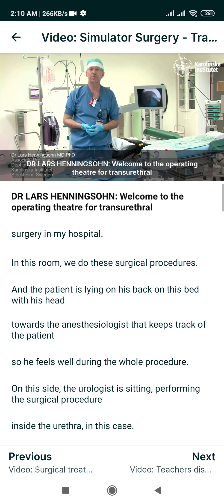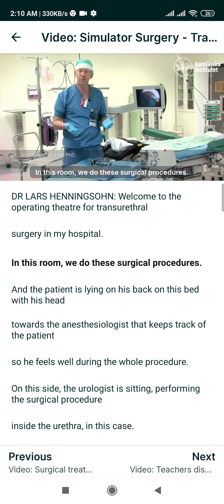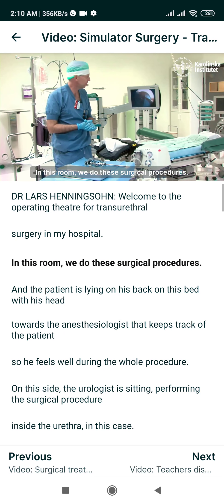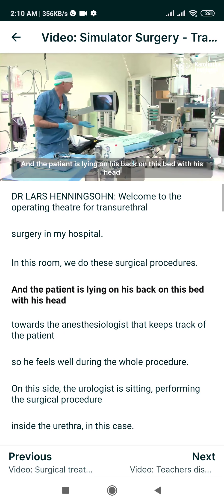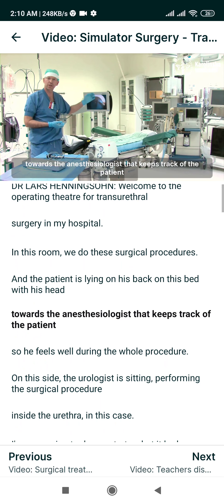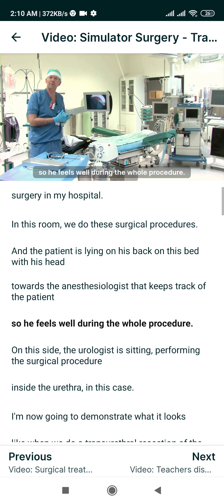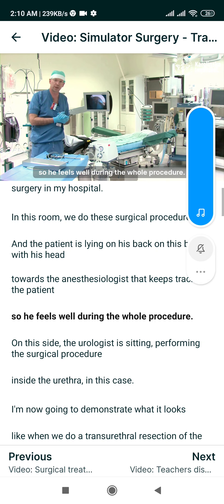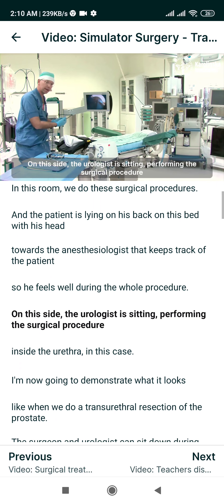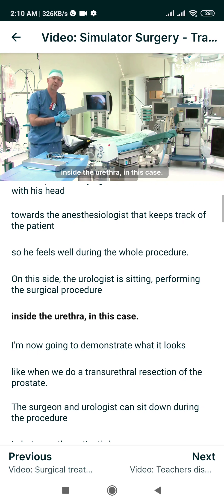This is the operating theater for trans urethral surgery in my hospital. In this room we do these surgical procedures and the patient is lying on his back on this bed with his head towards the anesthesiologist, who keeps track of the patient so he feels well during the whole procedure. On this side the urologist is sitting performing the surgical procedure inside the urethra.